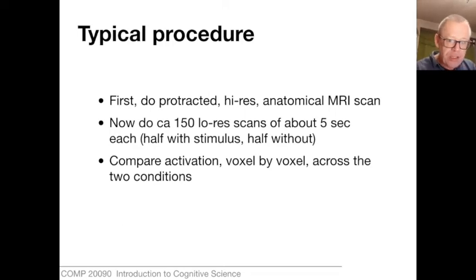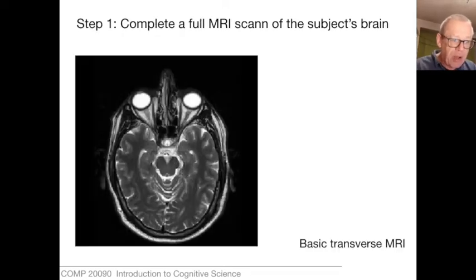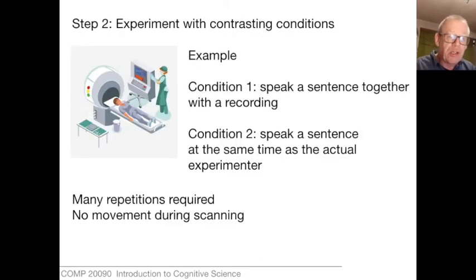So let's illustrate that. Here's first a complete MRI scan of a subject's brain, and then we conduct an experiment. And let's just say, for example's sake, in one experimental condition, you're speaking along with a recording of someone saying a sentence.